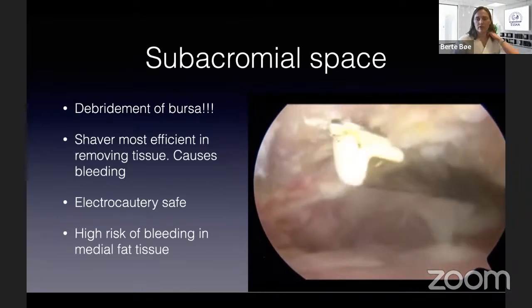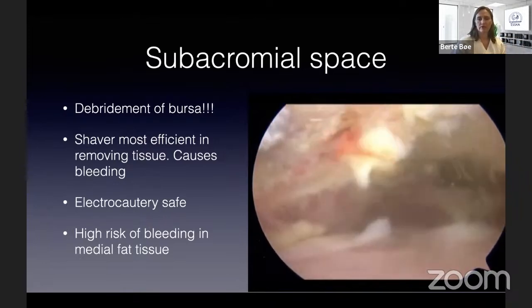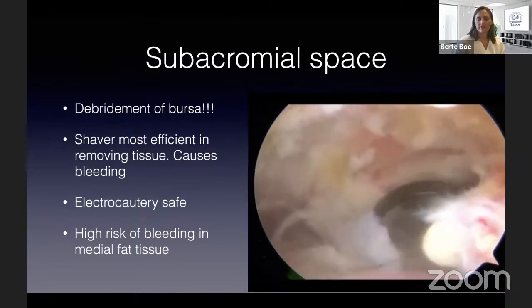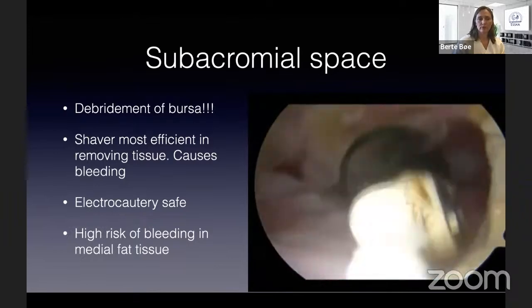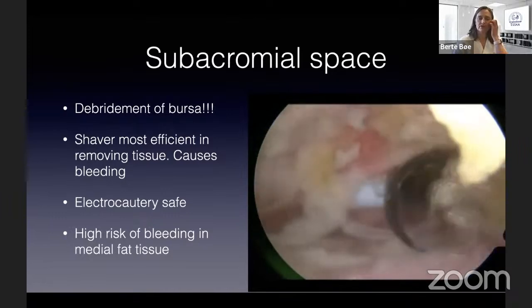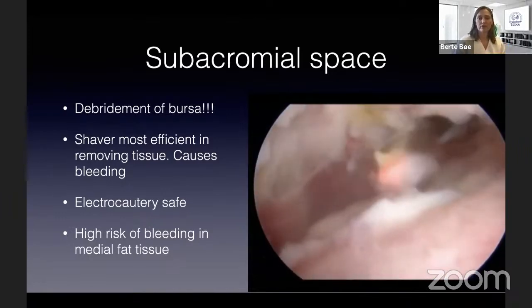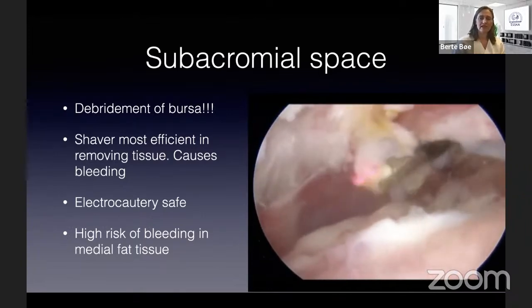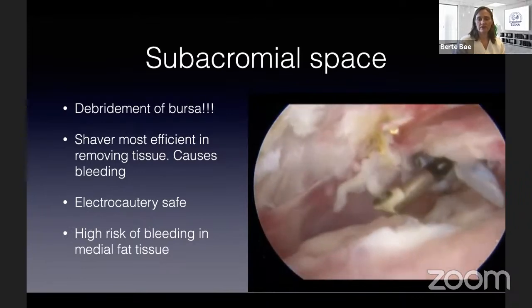And of course, doing a cuff repair is often a lot of cleaning up. So you have to do the debridement of the bursa. I like to start underneath the bone because that's always safe when you feel your instrument is on bone. And in some cases, you are tempted to use the shaver because it's more efficient to remove tissue. However, then sometimes you regret it because it starts bleeding. And especially when you go medial in the fat tissue, there is very often bleeding.